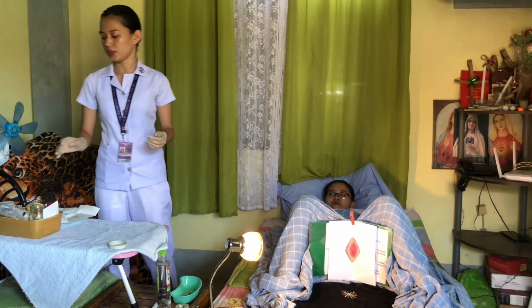Now I am going to lubricate the catheter for about 1.5 inches, being careful not to plug the eye of the catheter.